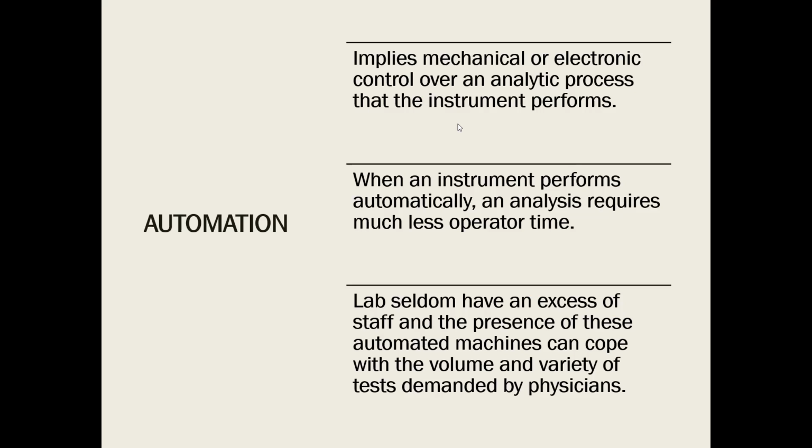Take note that when an instrument performs an analysis automatically, it requires much less operator time. You just have to load, and wait until the cuvette is discarded by your analyzer, and the results will automatically flash or will automatically be available in our laboratory information system, or what we call LIS. Remember, labs seldom have an excess of staff, and the presence of these automated machines can cope with the volume and variety of tests demanded by the physicians.